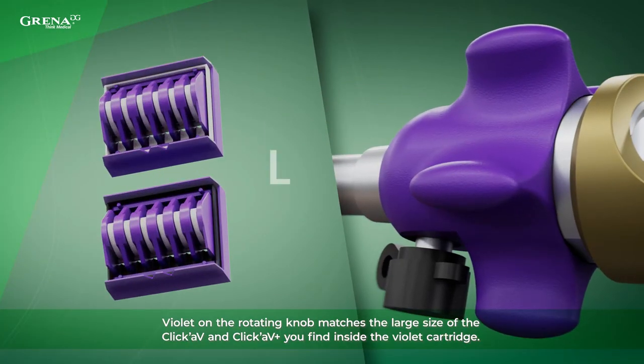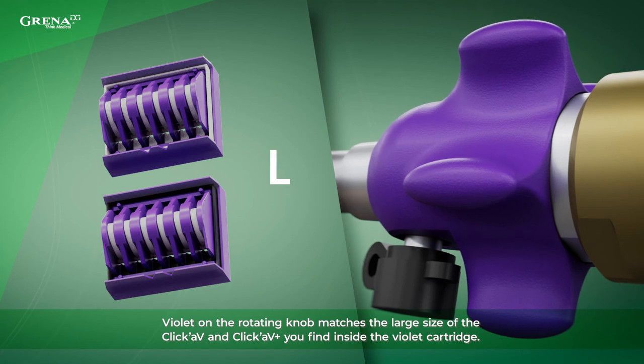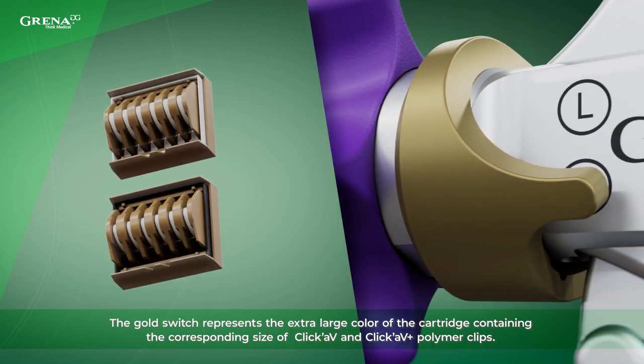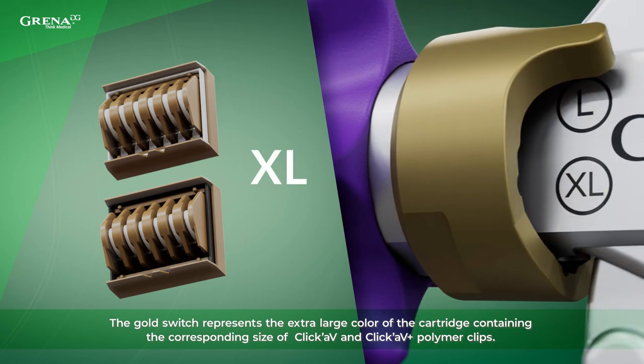Violet on the rotating knob matches the large size of the ClickAV and ClickAV Plus you find inside the violet cartridge. The gold switch represents the extra large color of the cartridge containing the corresponding size of ClickAV and ClickAV Plus polymer clips.